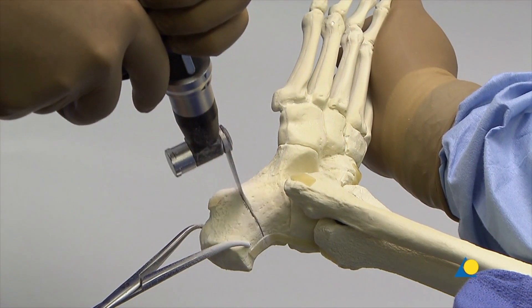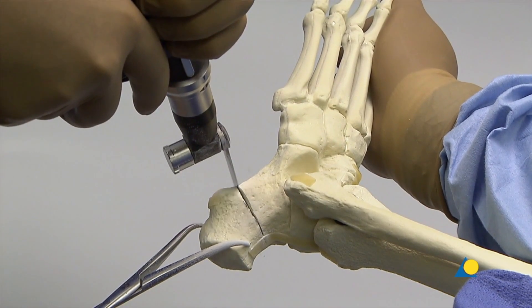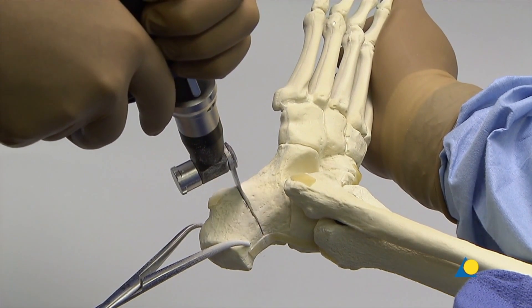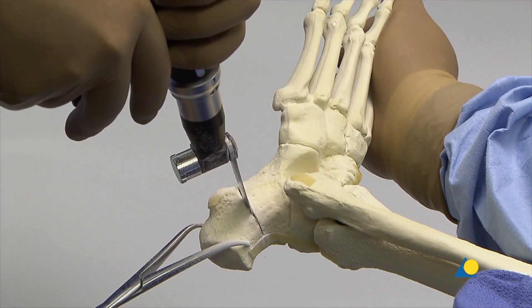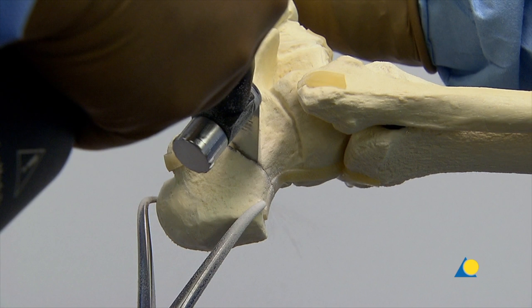The medial cortex can be felt through resistance to the saw blade. As an alternative, an osteotome can be used to complete the osteotomy and mobilize the tuber fragment. The osteotomy is completed with care.